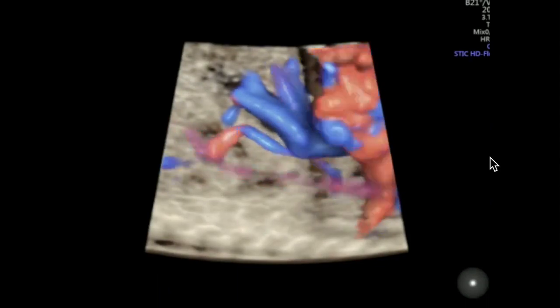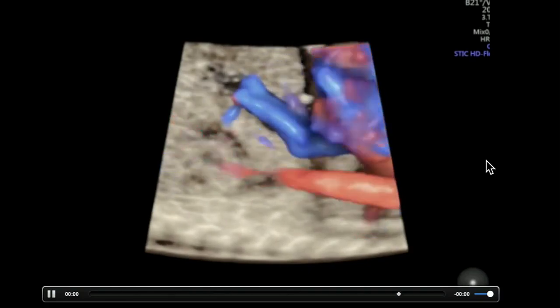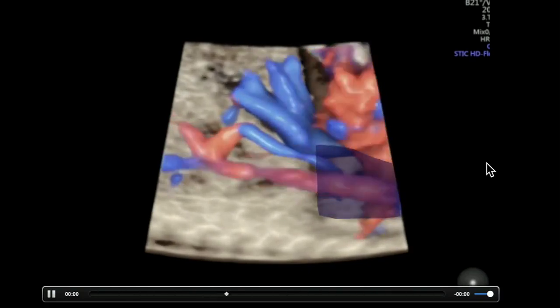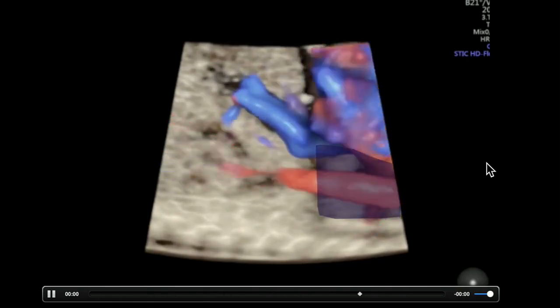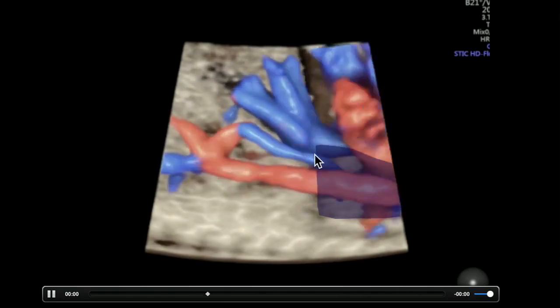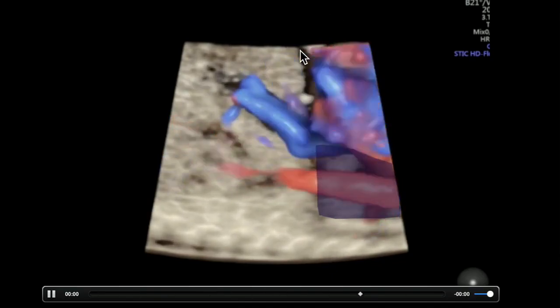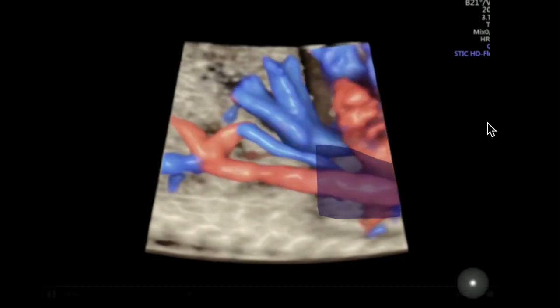Looking at vasculature elsewhere in the abdomen, this is a case of a fetus who actually had a left lower lobe lung mass. And I'm sure all of you know at that point you really start to assess where the vasculature to a lung mass comes from. Is it systemic or pulmonary? And in this case, this is a systemic vessel coming off the celiac trunk that pierces the diaphragm and feeds the mass. Now, what we're able to see with grayscale is really the proof that this vessel traverses the diaphragm. You wouldn't know where the diaphragm is without the addition of the glass body.